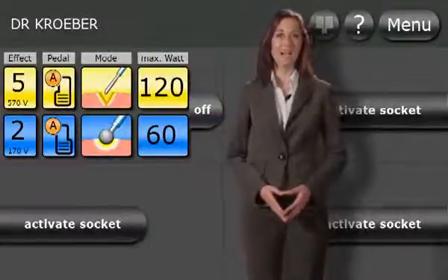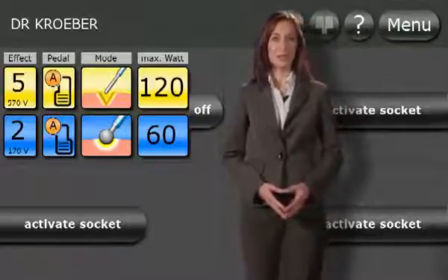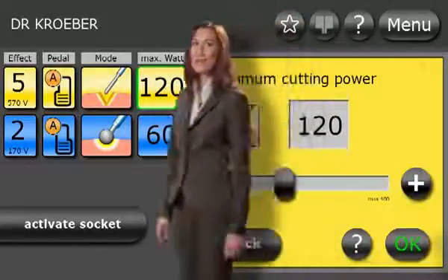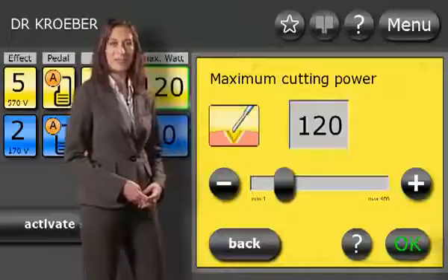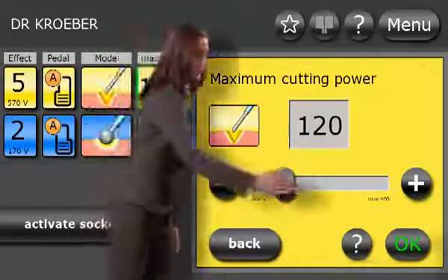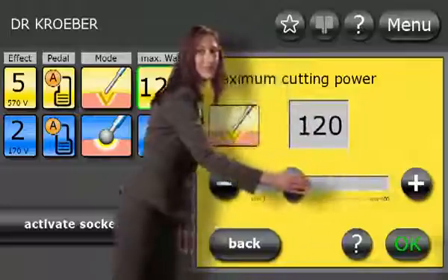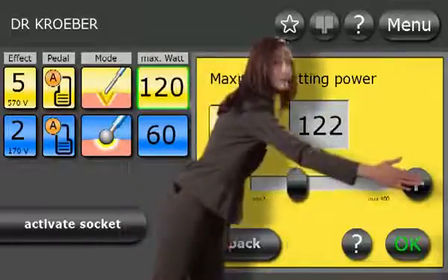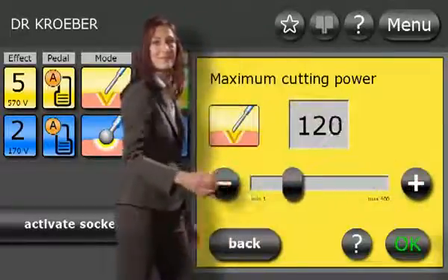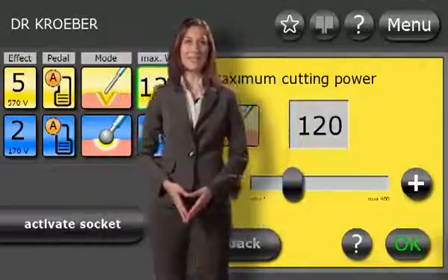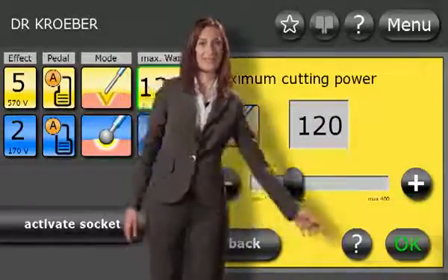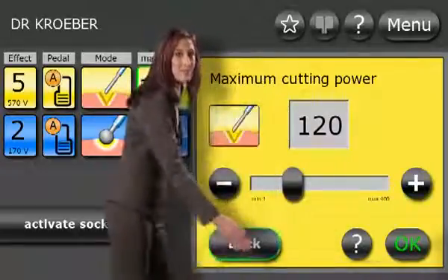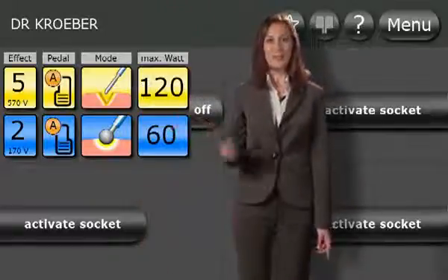To change the settings, simply touch the appropriate selection field with your fingertip — here, for example, the power setting — and adjust the maximum power using the slide control, or in individual steps using the plus and minus buttons. In each window, you can access further information by touching the question mark button. Touching the back button returns you to the previous display.